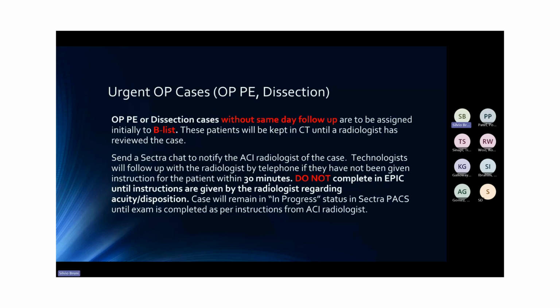Then, depending on what instructions are given by the ACI RAD with regards to acuity, disposition, and whether or not they will be dictating the case, complete the case based on those instructions.